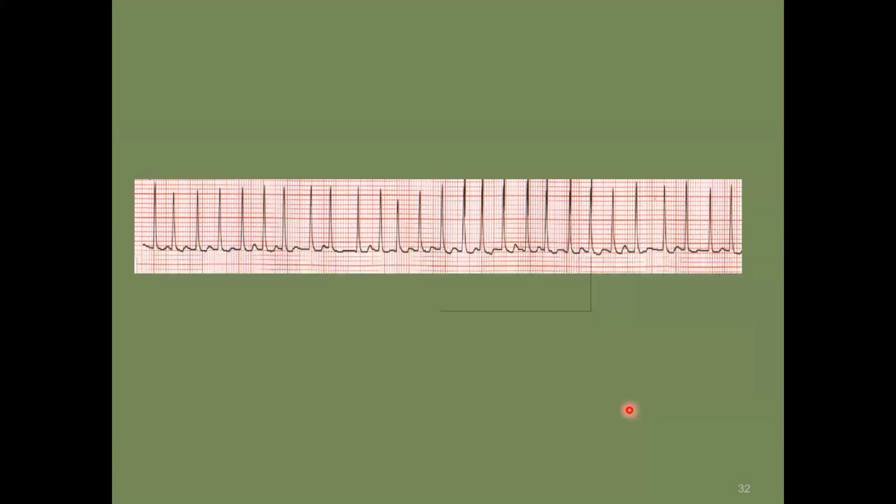Okay, so I'm seeing AFib with RVR, AFib, and some SVT. So you know what? You're all correct. This AFib with RVR is a type of SVT when your heart rate is greater than 150.